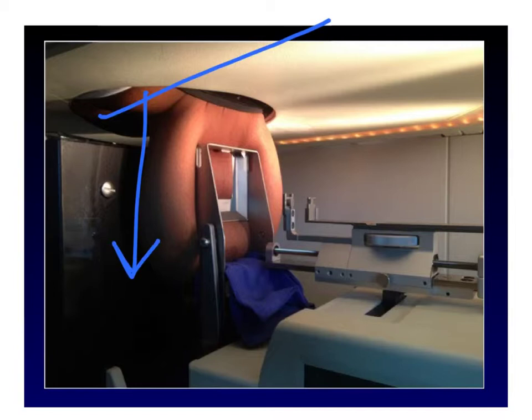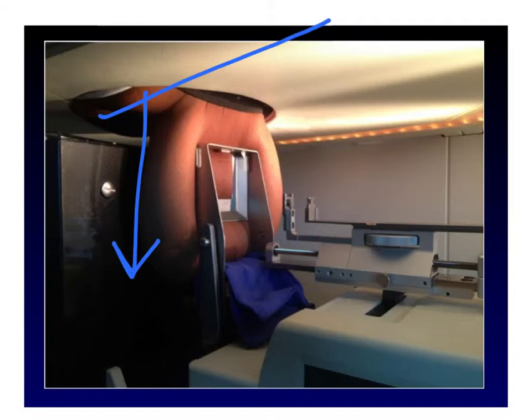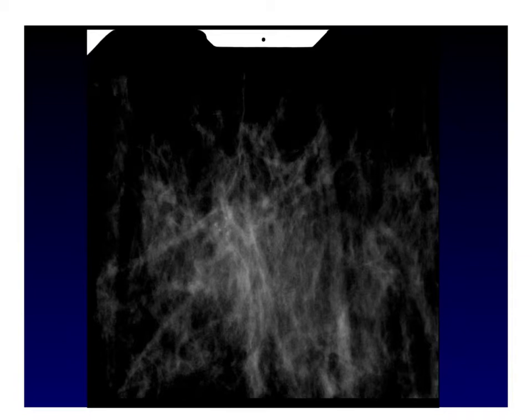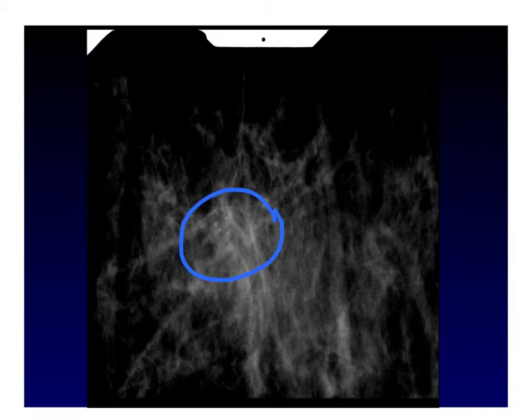The portion of the breast that is imaged is the portion being compressed by the compression plate. The inferior part of what's imaged is going to be closer to the nipple, and the superior part is close to the chest wall. Here's our scout image, and the calcifications are at the center. The right and left parts of the image are variable depending on whether the breast is positioned in the CC or the lateral view, and whether it's the right or left breast being imaged.